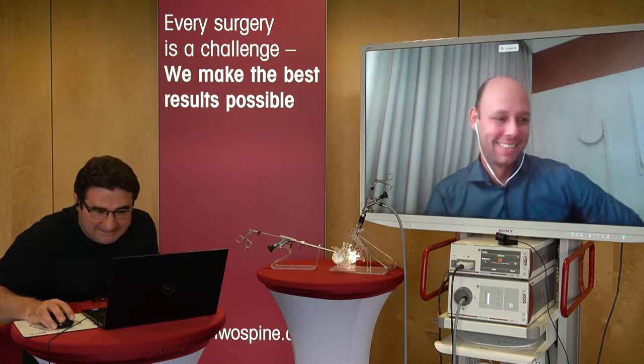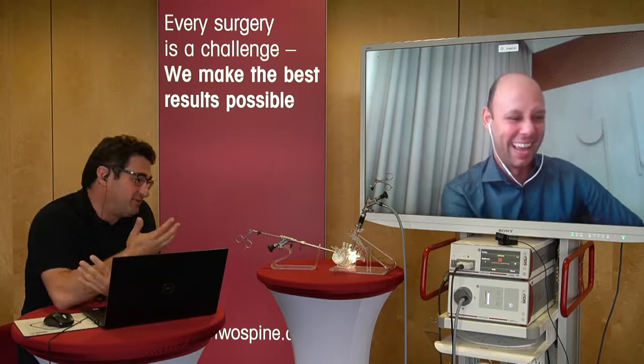Another question: how do you manage the dural tear? Okay, our common question, as I told you. Every webcast, of course, they are right to ask this. This can happen during the surgery, and how do we manage it? Yes, please. A dural tear appears in maybe 15% of the cases of stenosis. How do I manage it in my cases? A dural tear is not a problem in most cases. I never had a fistula where the liquor goes to the skin.